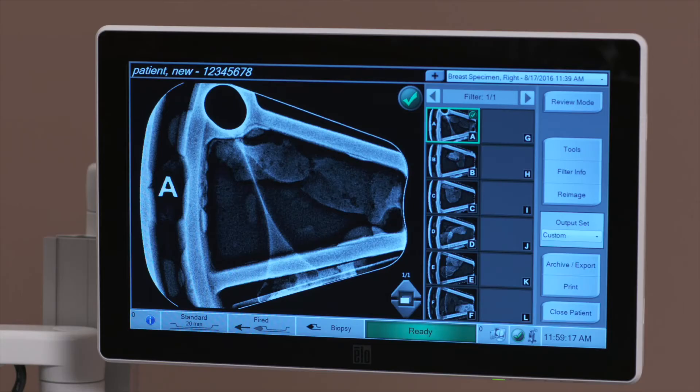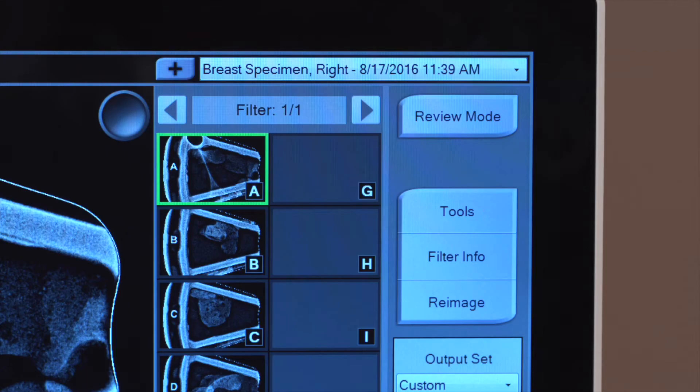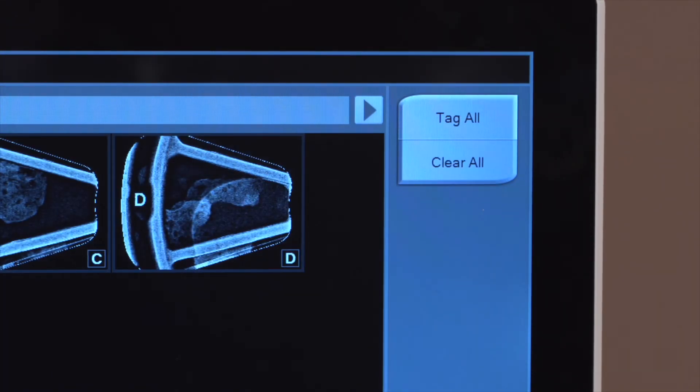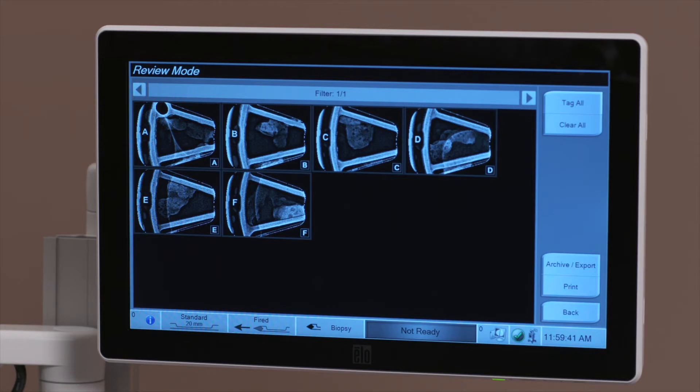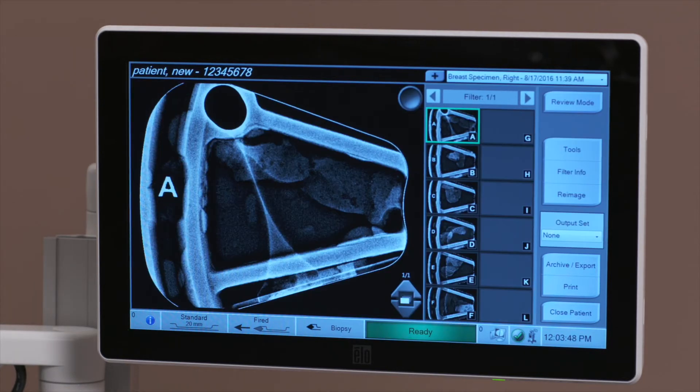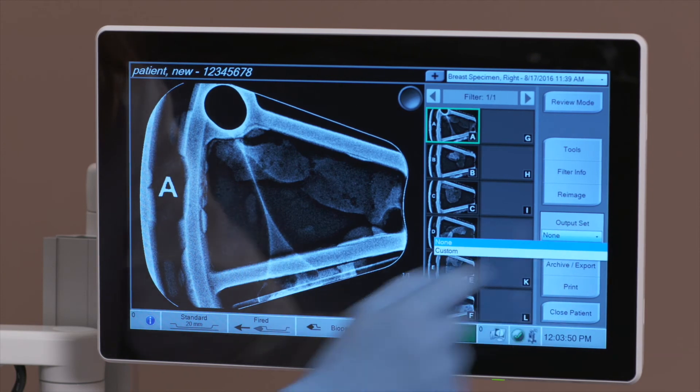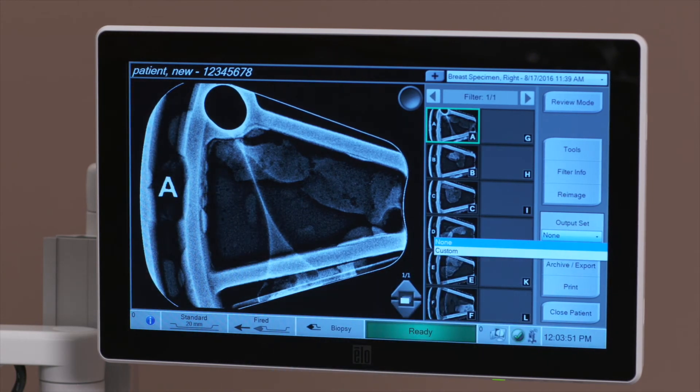If an image or images are tagged, the check mark is burned into the images that are exported, archived, or printed from the system. The review button allows you to view larger thumbnails of all the images at the same time. The images are sent automatically to the output devices in the selected output group when a patient is closed.